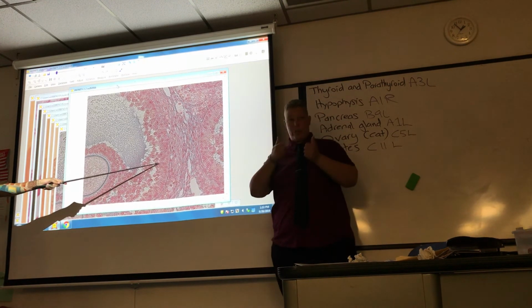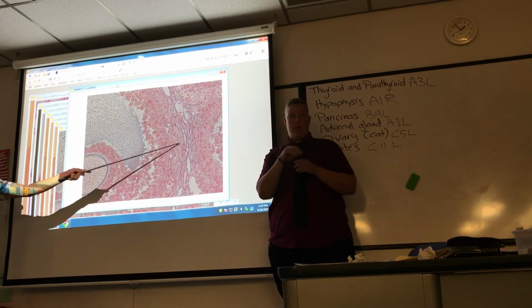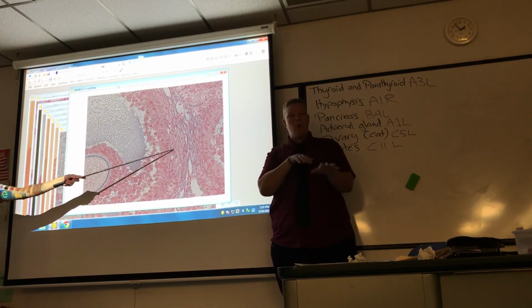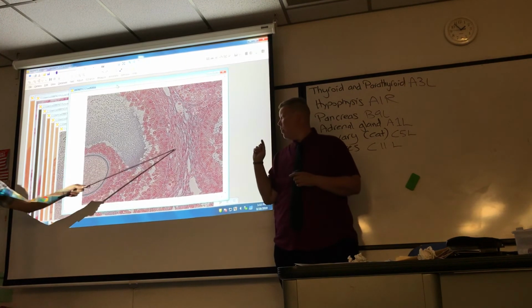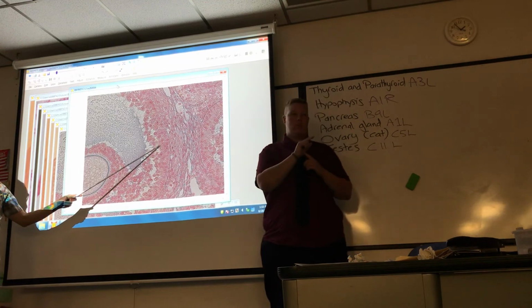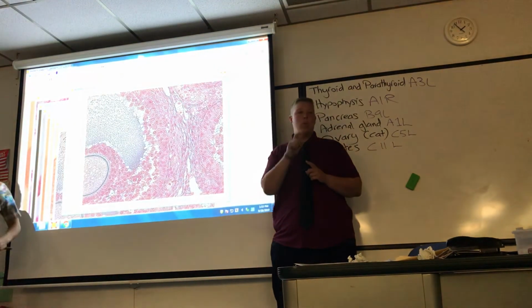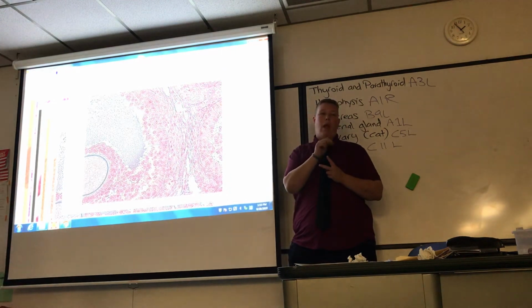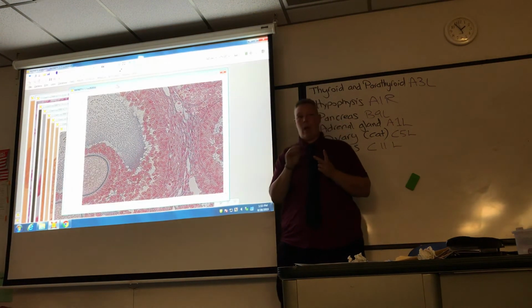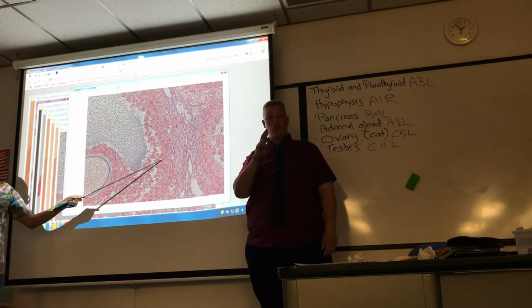Granulosa cells or theca? Granulosa. On the inner, the outer looks more fibrous. Theca. Okay. They secrete the androstenedione, transferred here, converted to estrone. You don't need to know that for the histology quiz, just the identification of theca or granulosa cells. Okay, I'm moving on. Let's see what's next. One more time. Sure. Theca, granulosa cells. Yeah.